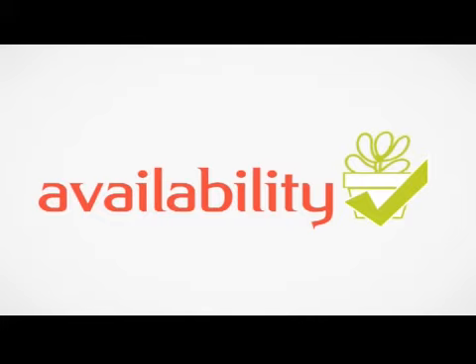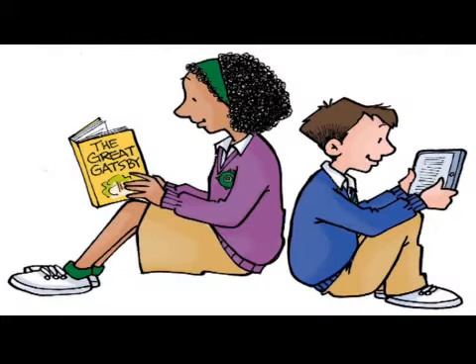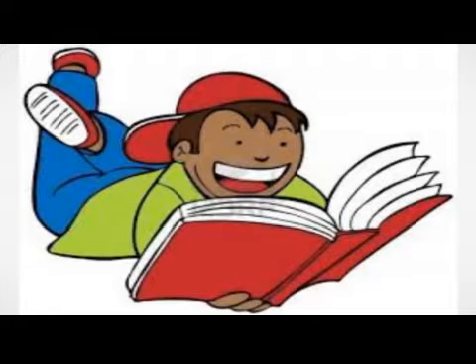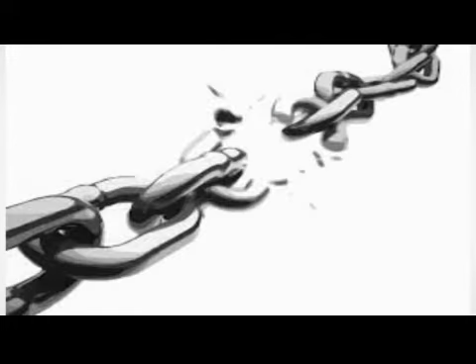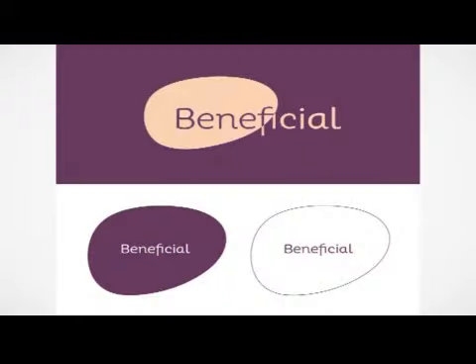Advantages of the spectacle magnifier: availability of a range of magnification. Both hands are free while using. Once used efficiently, it can be used for longer periods. Disadvantages of the spectacle magnifiers: exact reading distance is important. Short reading distance with high powered lenses. They are more fragile than magnifiers, which can result in scratching or breaking. Good lighting is needed at close distance. Often a reading stand is beneficial to bring material close.